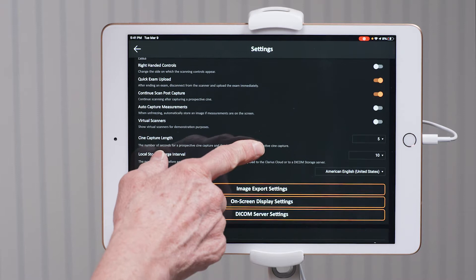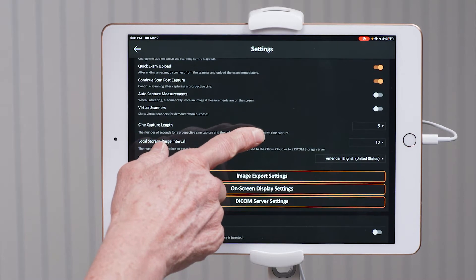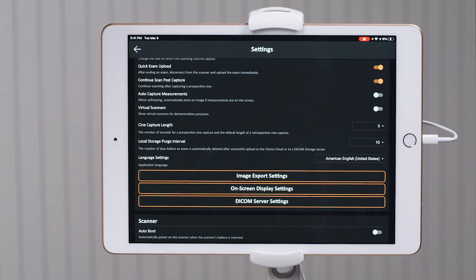As I continue to scroll down after right-handed controls, the quick exam upload and the continue scan post capture are both off in your app right now. I turn those on so that I am more efficient in doing my exams. Quick exam upload — once you select to end the exam, it will automatically disconnect your scanner and upload the images to the Clarius cloud. I recommend the continue scan post capture be on; after you've obtained a Cine capture, it will continue scanning.